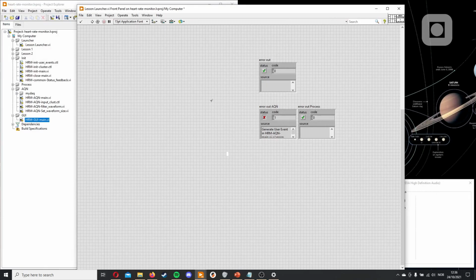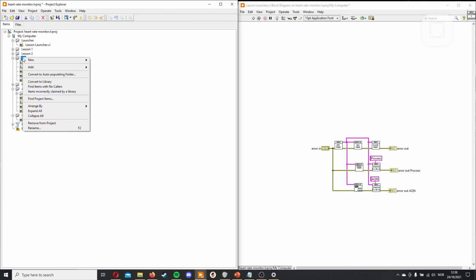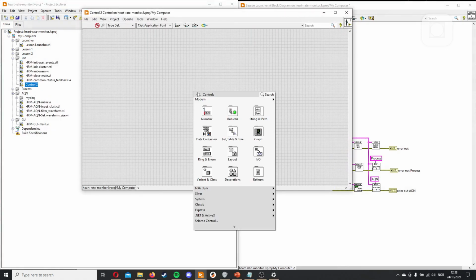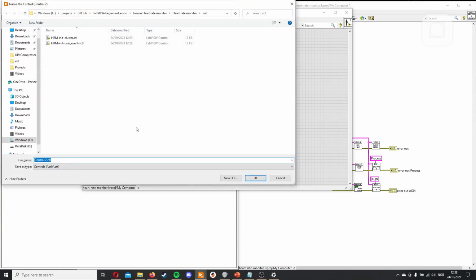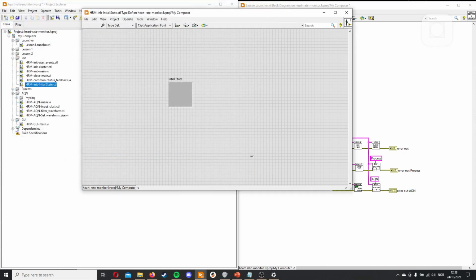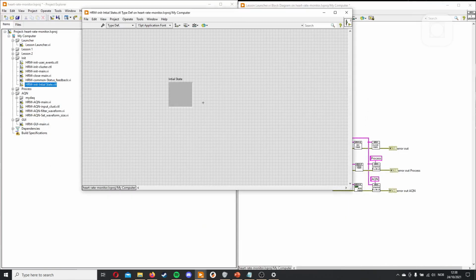Now, we want the GUI and the acquisition to start in the same state. So we'll start by making a new type def, and here we'll set up a cluster. We'll call it initial state, and we'll save it as init. It's part of the init, so we'll just keep it with the init. And we can add the indicator from the GUI as it looks nice and has all the right naming. There. Auto size vertically, I like that one.